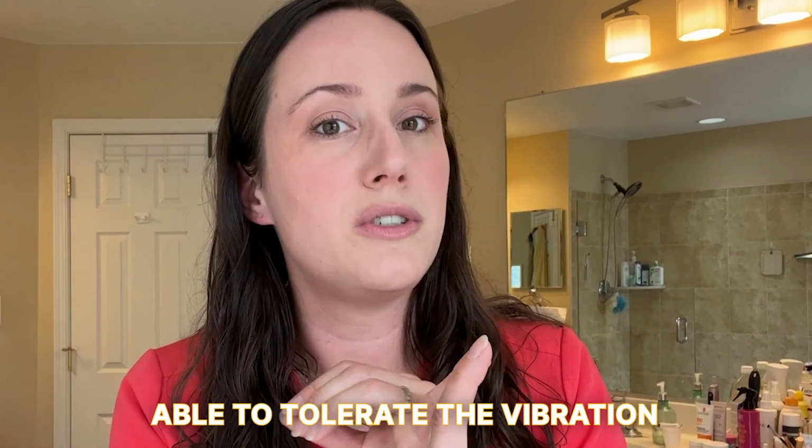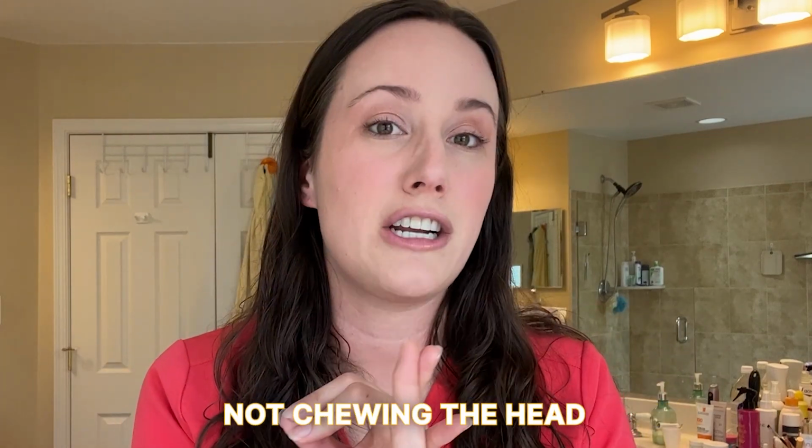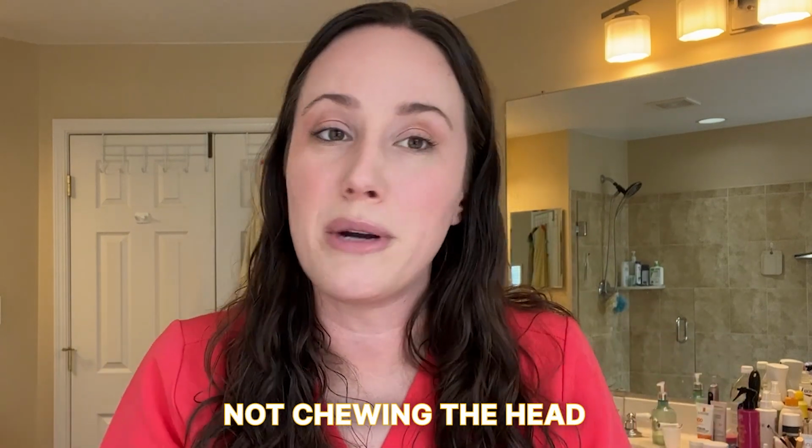But right now, these two are good. You're not going to go wrong with them. Me personally, I like the OralB better, but really you're going to be just fine with either. Just know this one's really loud. If you want to upgrade so it's not so loud, get the grown-up version IO6. It's a little more quiet, but these are the way to go. And really the only criteria for your child using an electric toothbrush would be they're able to tolerate the vibration and the sound, and they're not chewing down and biting on the brush head. Otherwise, you're good to go.